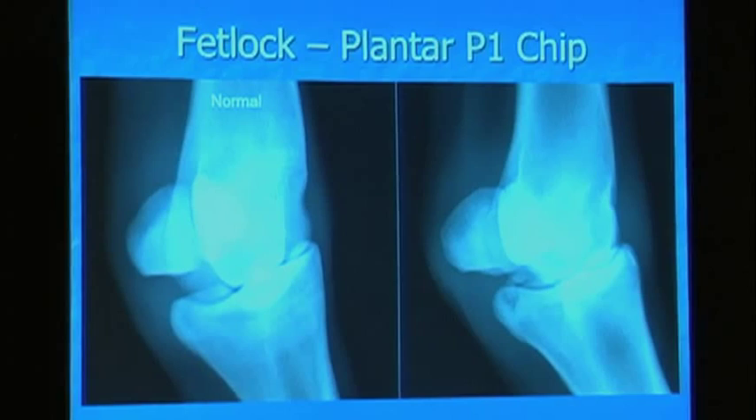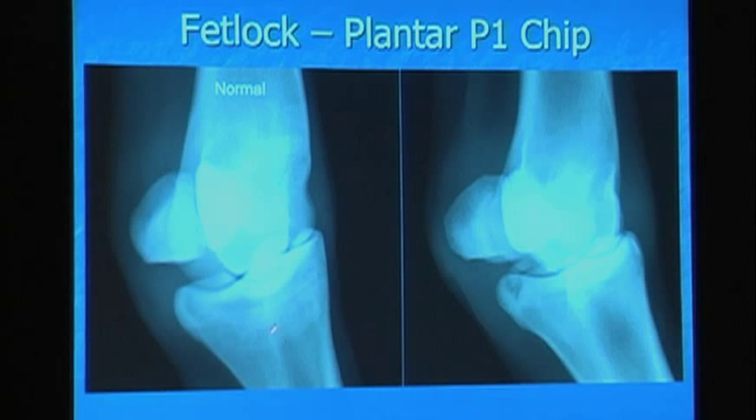And then we also have what's called a plantar P1 chip. We have the normal on the left here. Here's your sesamoid, distal cannon, P1. And in this joint over here, you actually see this large fragment that's on the top of P1, right underneath the sesamoid. We know these do very well with surgery, but how often do you take them out and do you always recommend removal? Here, size matters — this is an opinion because there's not strong data, but size matters here.